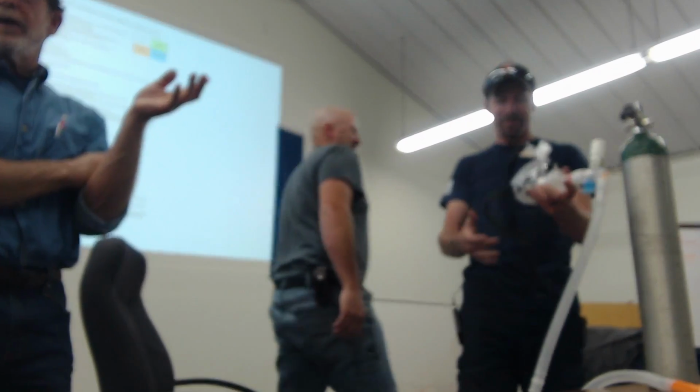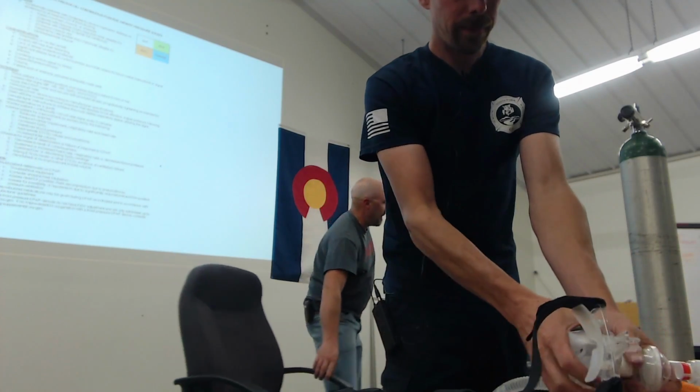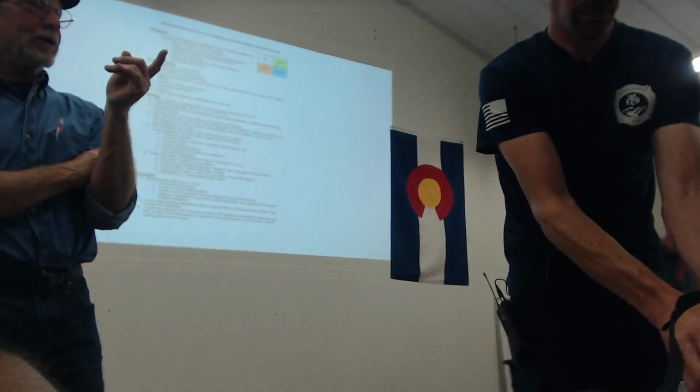The CPAP can be used just as we demonstrated by itself. If a person with CPAP also has a lot of evidence of airway obstruction, as evidence of wheezing or something, show us how you might hook up a neb treatment if you decide you want to get a neb treatment to the CPAP patient. Sure.